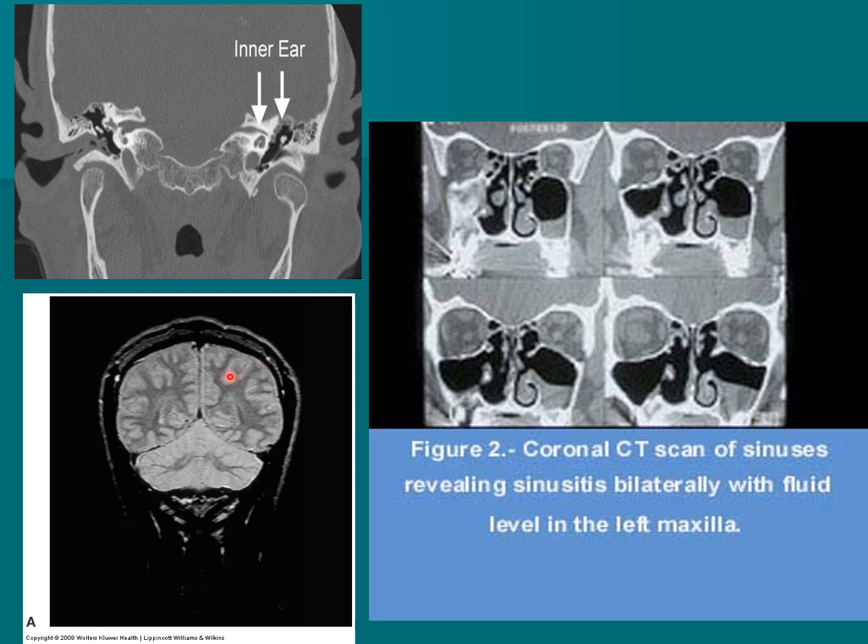Here, I think this is an MRI, but it's demonstrating that in the coronal plane, you can see the cerebrum and the cerebellum, and you can see where the tentorium would go. So you can see if something was above the tentorium or below it, because the tentorium is that part of the brain lining, the dura that separates the cerebellum from the cerebrum.